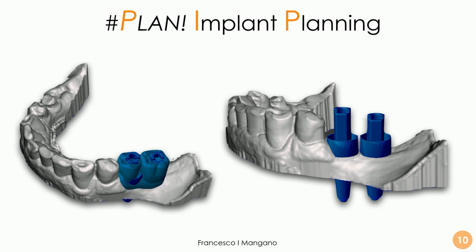Usually we tend to consider more the volume and then secondly the wax up, because we have a lot of components to correct eventually any inclination or excessive inclination. We can work with the prosthetic component, but the bone is the issue, in this case, and the prosthesis is secondary.